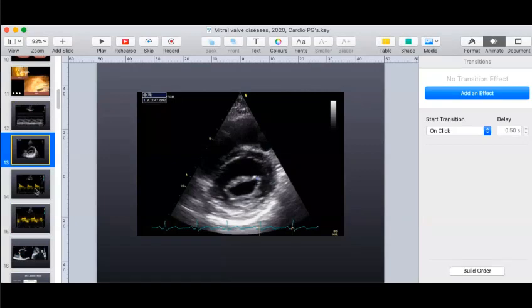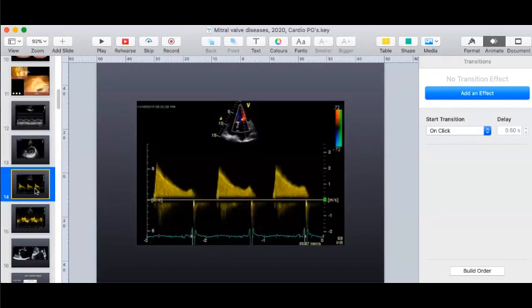And next, let us look at this. What method would you say that we would like to get a mitral valve area here? What would you call this? Again, very simple, very basic, but you know, just running through the whole thing. Pressure half time. Continuity equations. Okay. So how would you calculate the mitral valve area from pressure half time?